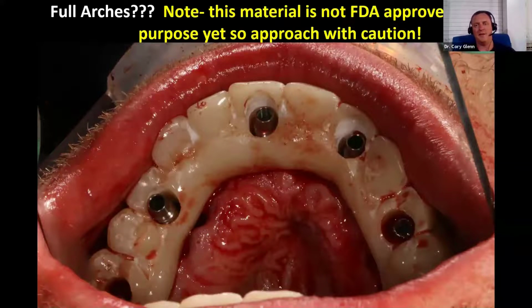The cylinders were right in the middle of the hole. And all you've got to do is just rinse and dry this and then squirt some acrylic or dual cure composite to join the cylinders to the temporary. And that gives you an immediate load prosthesis, way, way stronger than converting a denture because you haven't ground out tons of material that you have to patch back together. So I think that's a big part of why these are holding up so well.